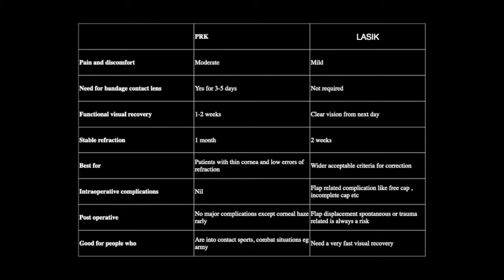Intraoperative complications are not there in PRK, whereas in LASIK, flap-related complications can happen. Postoperatively, there is no major complication in PRK, except in very few individuals, corneal haze can happen. Flap displacement, spontaneously or trauma-induced, is always a risk in a patient with LASIK.